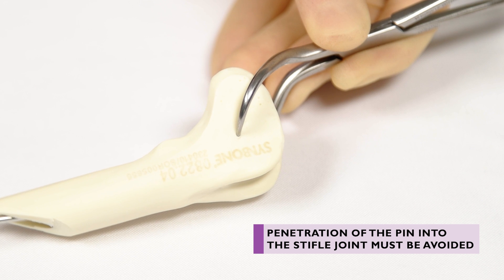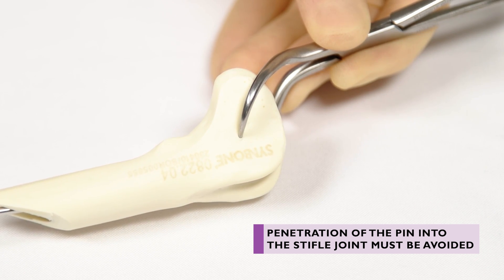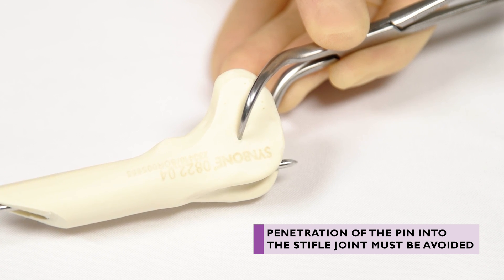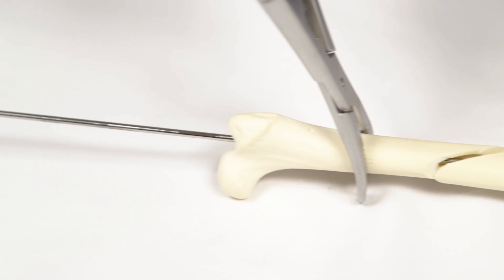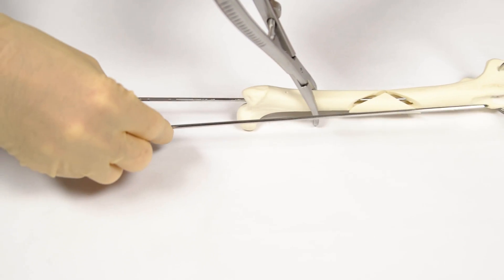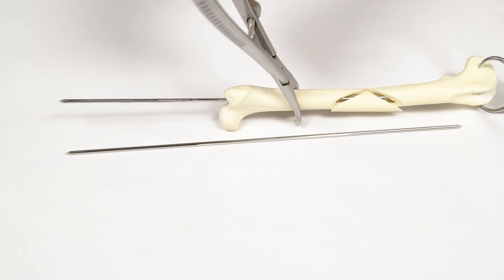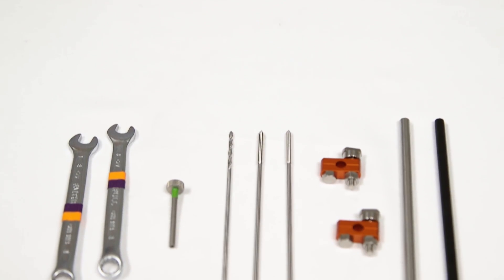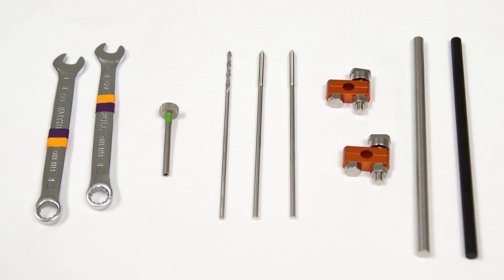Driving the pin must stop as resistance is felt from the soft tissue's tension. If the pin is driven further at this point, it may penetrate the distal cortex into the stifle joint. The proximal aspect of the pin is left long at this stage. A second IM pin held on the outside of the limb as a comparison allows the surgeon to check length and positioning. Once the IM pin is placed to the surgeon's satisfaction, placement of the ESF can begin.